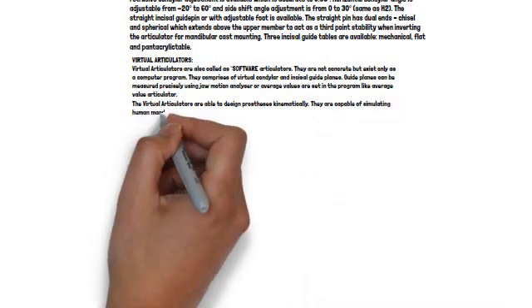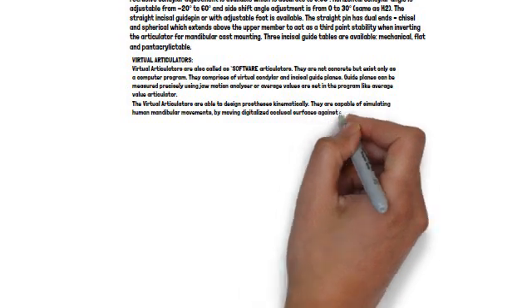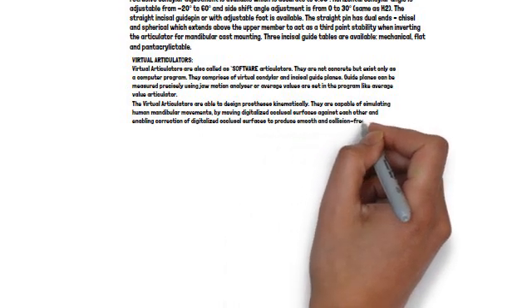They are capable of simulating human mandibular movements, by moving digitalized occlusal surfaces against each other and enabling correction of digitalized occlusal surfaces to produce smooth and collision-free movements.